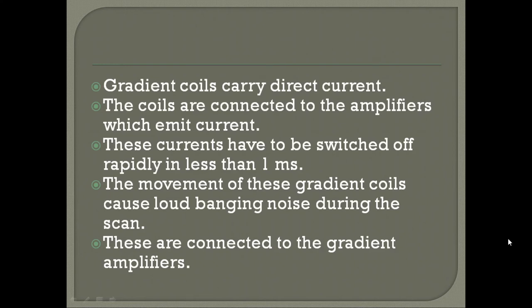All these coils carry direct current. These coils are connected to the amplifiers, which are present in the system component room, and these emit the current. These currents have to be switched on and off rapidly in less than 1 millisecond. It is the movement of these gradient coils that causes the loud banging noise during the scan.